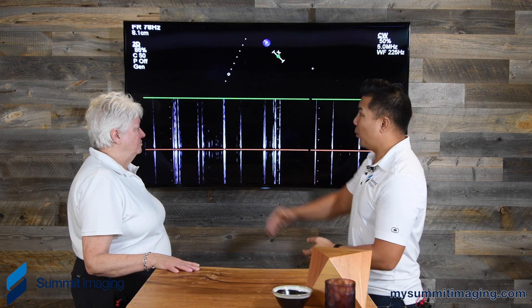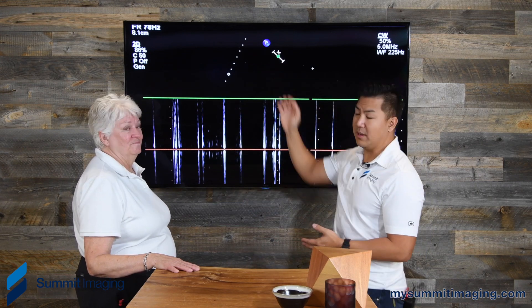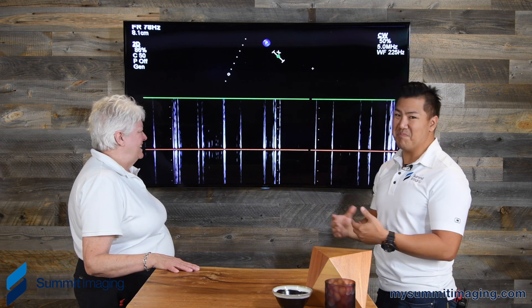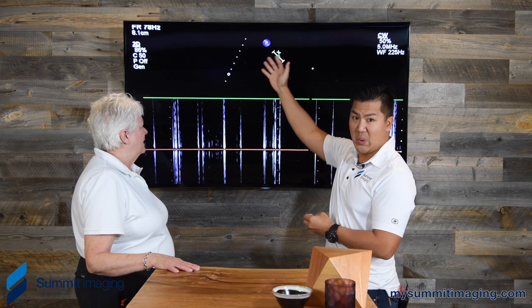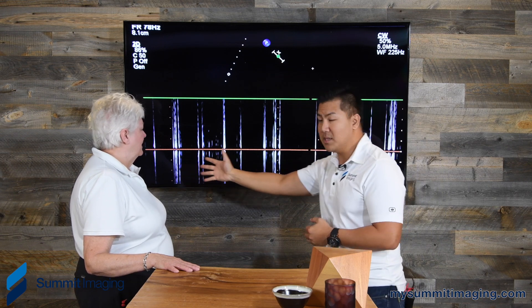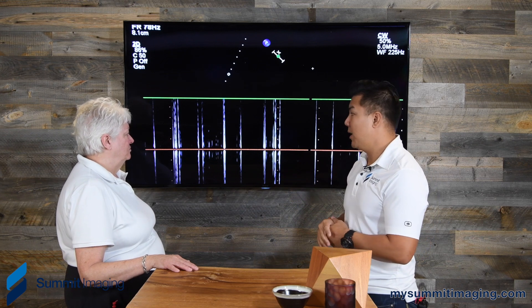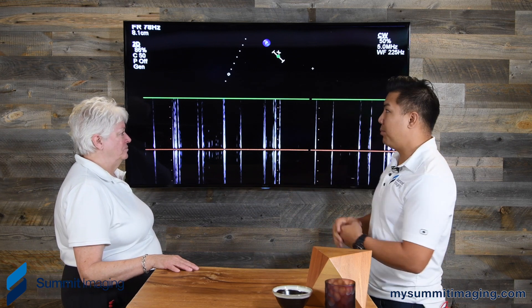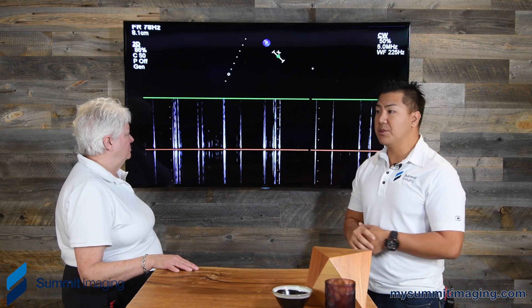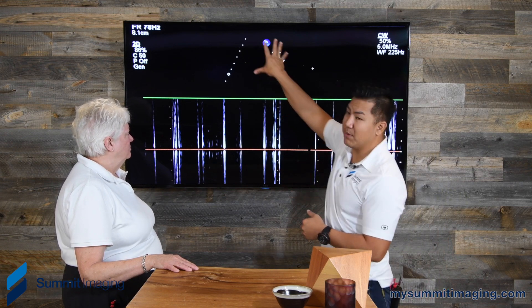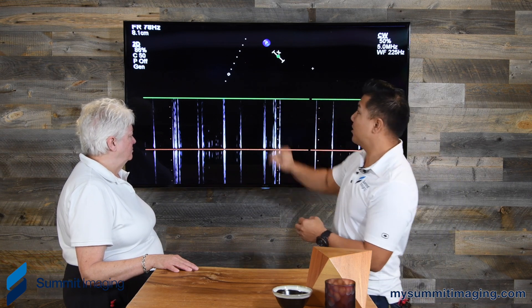Just to be clear, our gain is at 86% on this image and there is nothing. So obviously there are some big problems here. The channels carrying the image aren't showing anything, but there is some data being transmitted — unfortunately, incorrect data. This is a pulsed wave or continuous wave failure, and one of the most common things that we see. In this particular case, this is a really bad probe, so there's no image at all.